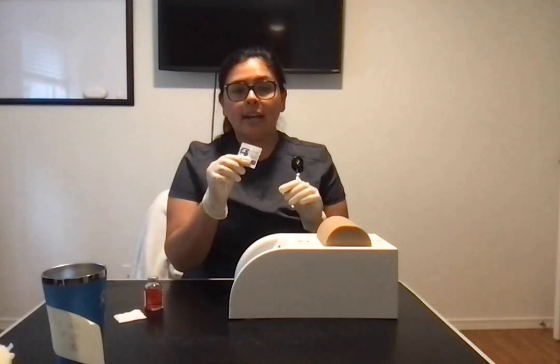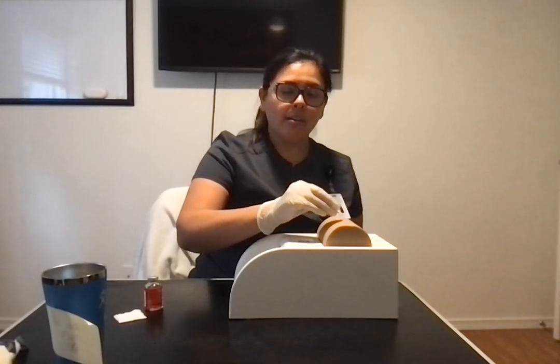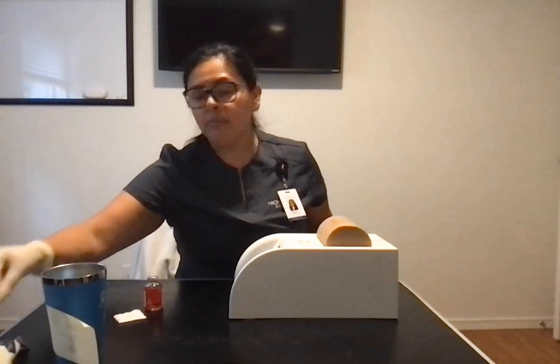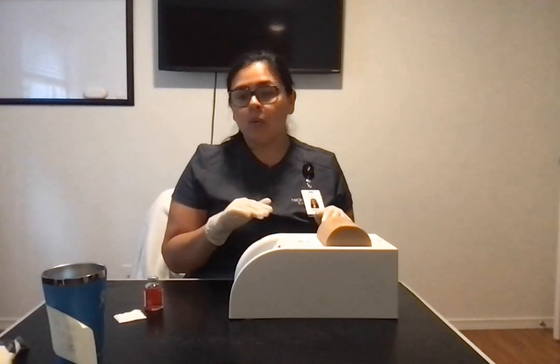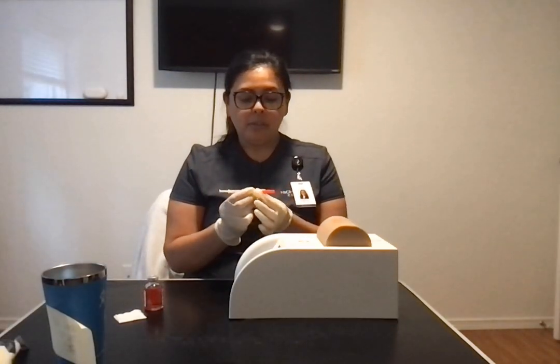I'm going to clean the area with an alcohol wipe. Trash. Starting at the center, I'm going to work my way out to about 2 centimeters width, just making sure that it's nice and clean. I'm not going to repalpate the site. I'm going to let this fully air dry so that the alcohol wipe can do a good job of clearing away the bacteria. Next, I'm going to inject the patient with the medication with my dominant hand.